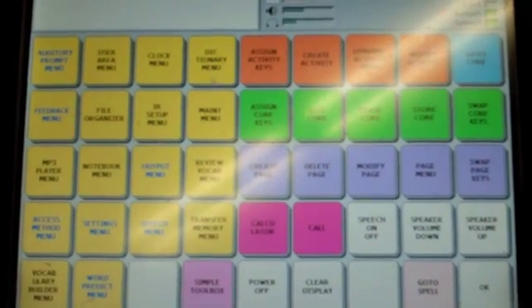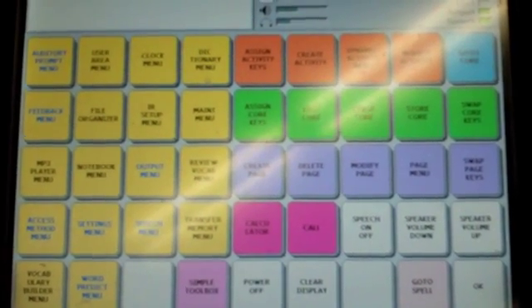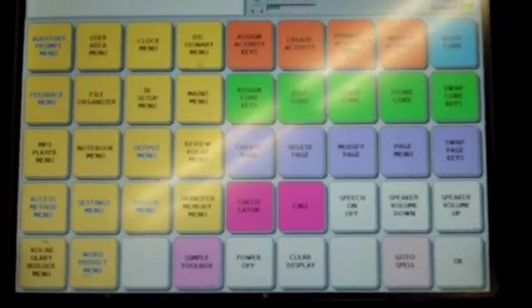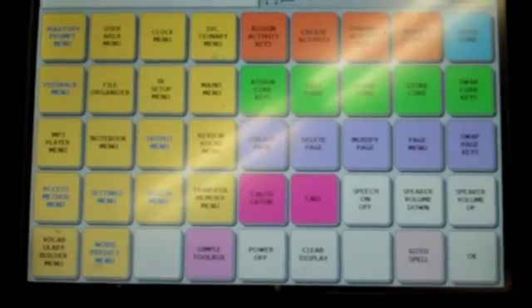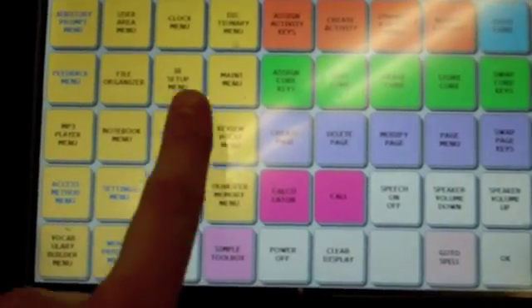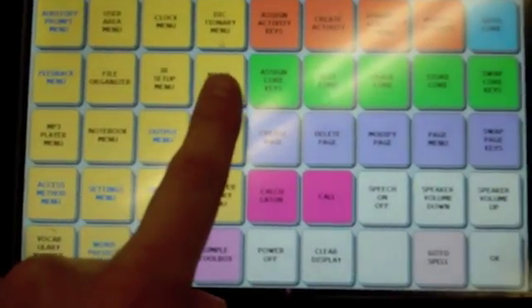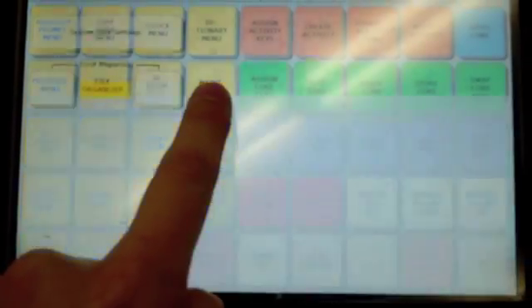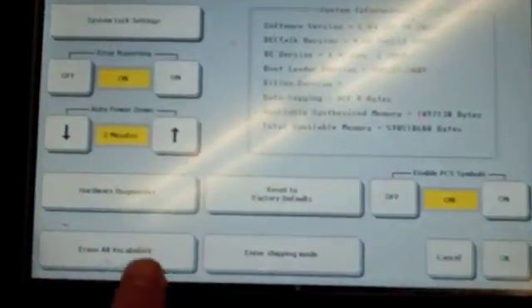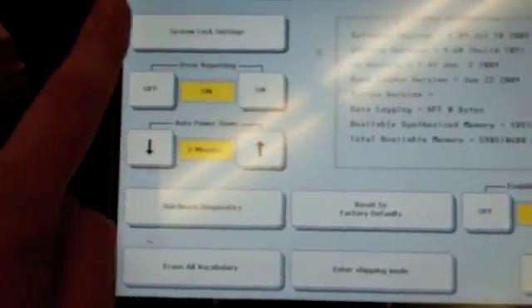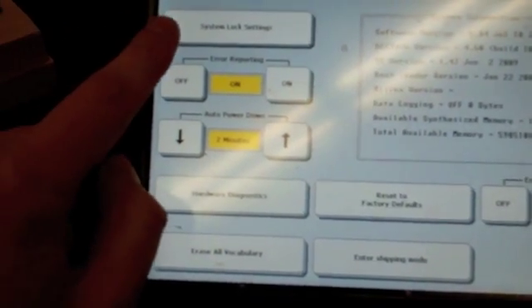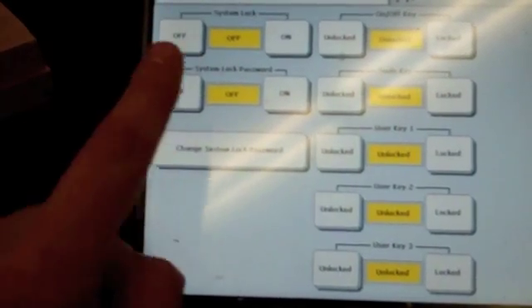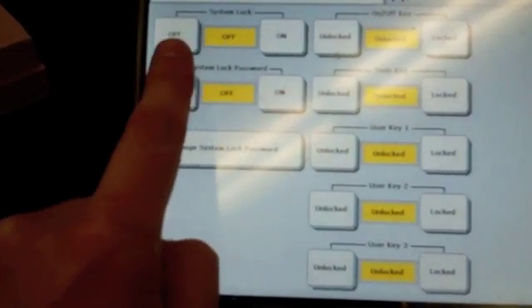If you want to lock the system so a student can't get into the settings, you'd have to go to maintenance menu. From maintenance menu, there's a system lock settings button, which you'd click on, and then a system lock off or on.